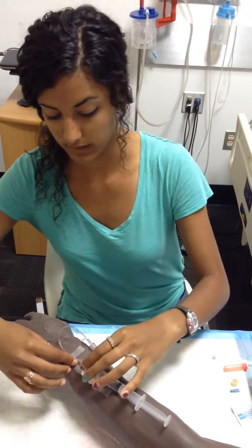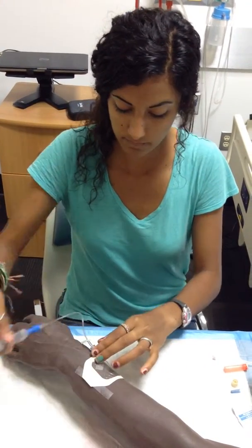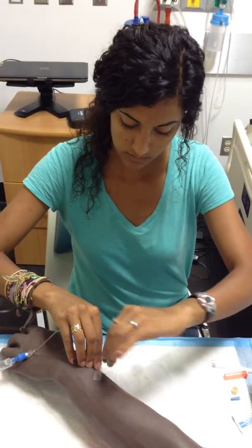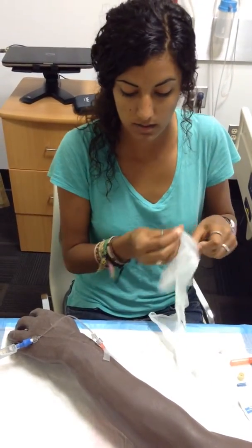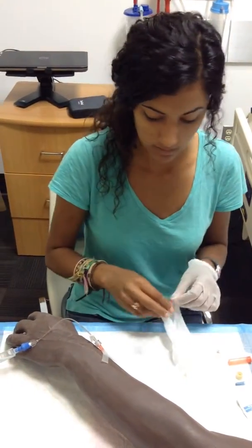So I remove the tape, loosen the Tegaderm, loosen the tape, and then I will apply my gloves.